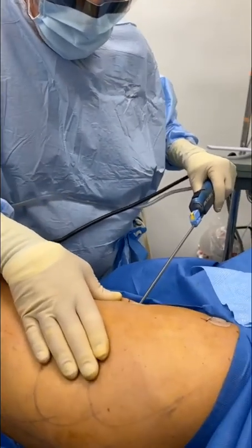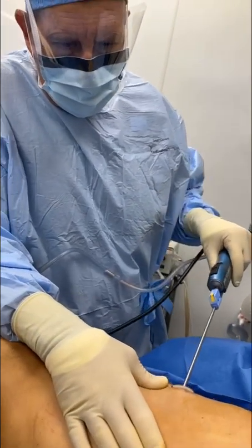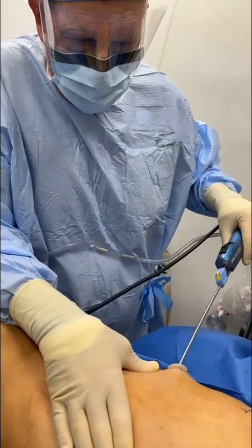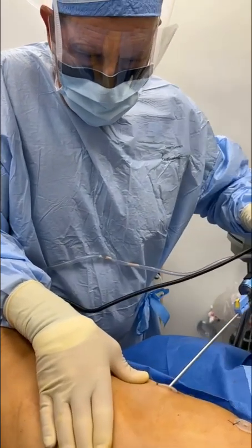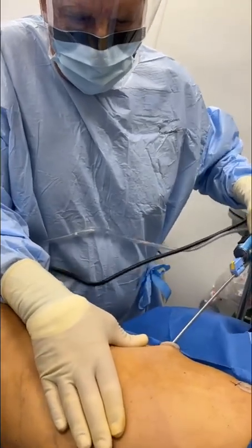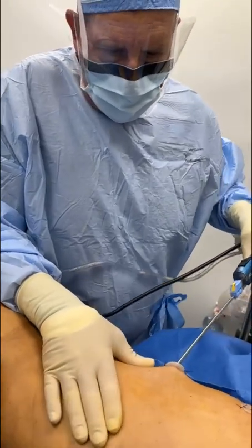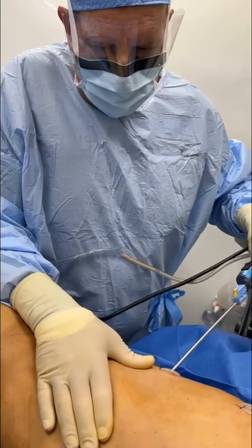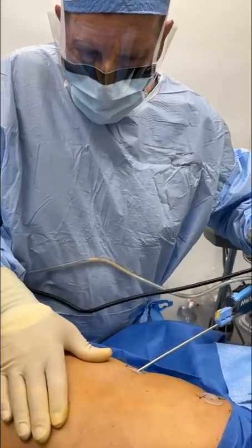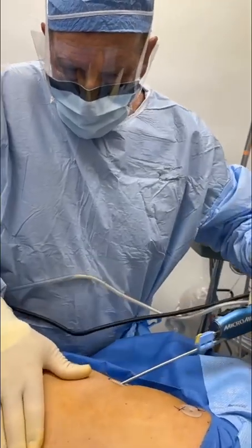The key to obtaining this beautiful yellow aspirate is: number one, instruct the patient not to take any aspirin, no ibuprofen, no vitamins, no herbs for two weeks before surgery. Do this under tumescent anesthesia and wait at least an hour before you start — that's the part that's difficult for most surgeons. They want to infiltrate in five minutes and go, go, go, and then there is going to be a lot of bleeding. The operative technique: go very slow. You see how my strokes are very, very slow and very gentle.